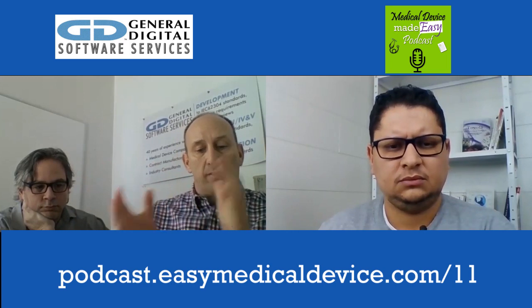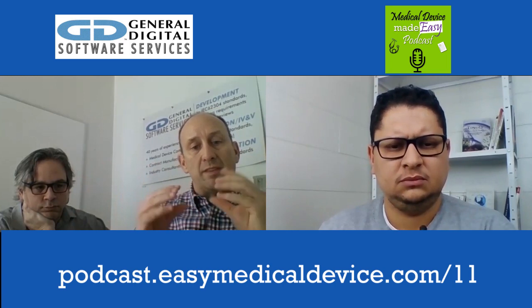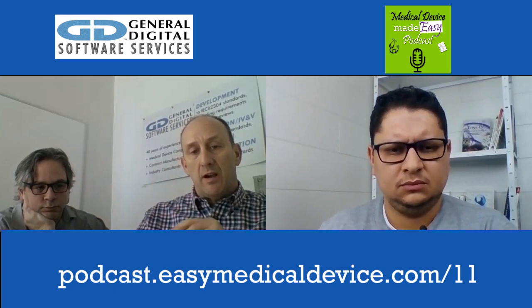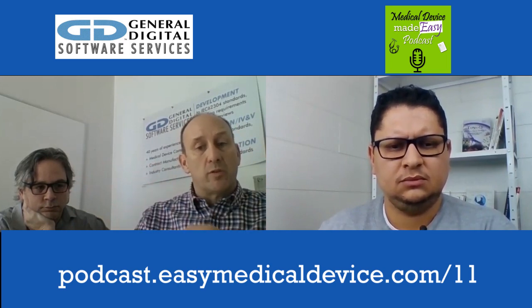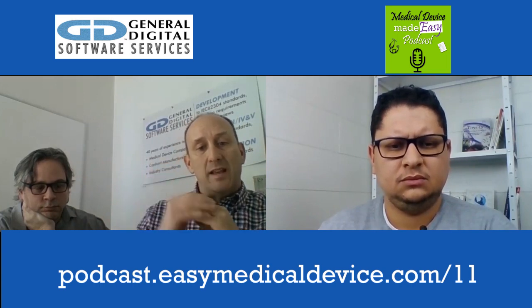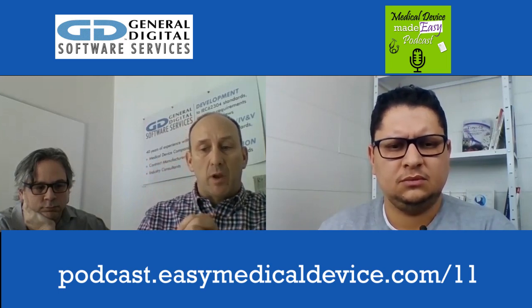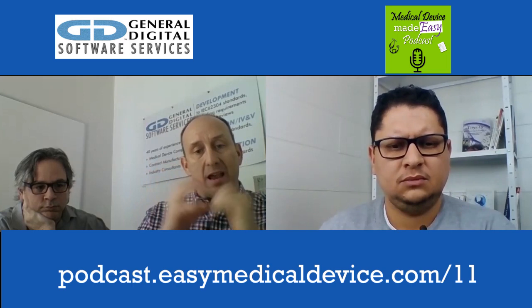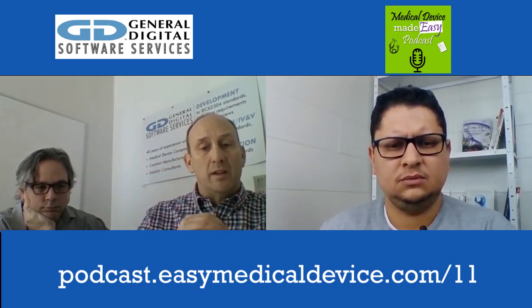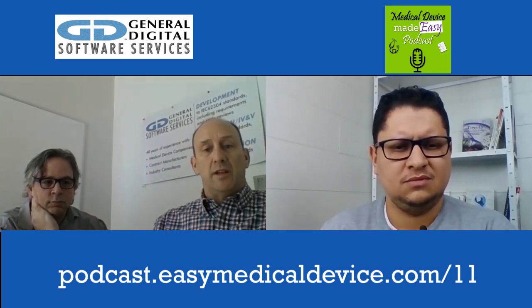And on the first part, the device, depending on how many tests need to be performed to prove that the data is real and the FDA will trust it, is really all over the board right now. Some customers want to do regression testing as quickly as possible, but coming up with the metrics to measure when it hits that threshold is still something that even the FDA is struggling with. We're working on a device right now that has some of those AI components to it, and it's very, very difficult to say when it will be ready to hit a certain threshold. And then, Rafael can talk to you a little bit about those thresholds and how to test for that.